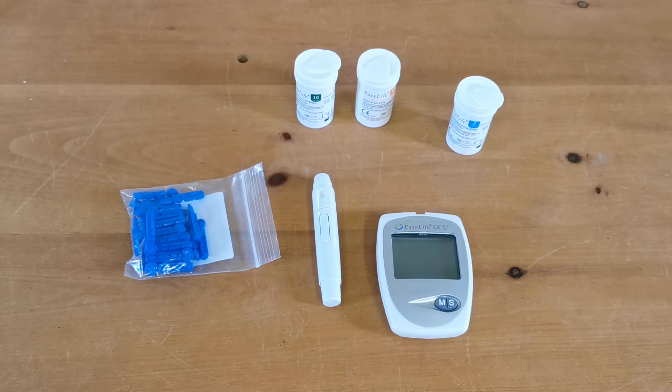Welcome back to this product demo for the EasyLife GCU meter. In this video we're going to run you through the procedure for performing your first test.